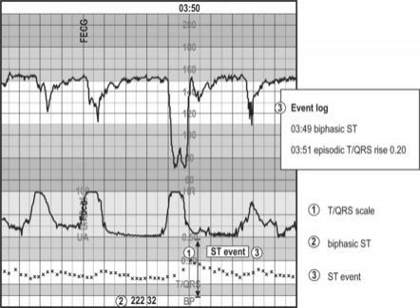This resulted in the number of cesareans and operative deliveries being the same in both groups. They found this was because women who were being delivered for non-reassuring fetal heart rate tracing in the control group were now being delivered for dystocia in the study group. It didn't change where the women ended up, it just changed the reason they got there.